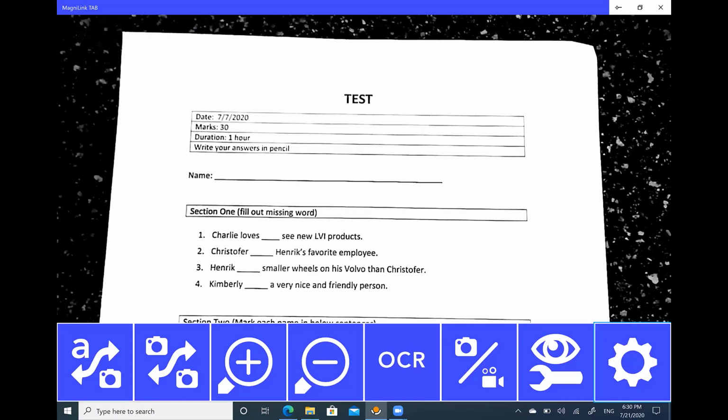So it's really cool because I was doing a training just on Friday with someone that just had light perception, and their comment to me was, oh my gosh, I can show this off now. This is so great. It works. I think this is even great for people that have even less vision than I thought before, because again, you guys work with Narrator so well. So we wanted to make sure that everybody knew that you could now be using Narrator with the product. And of course, if you double tapped on the icon, it would perform what it was doing.